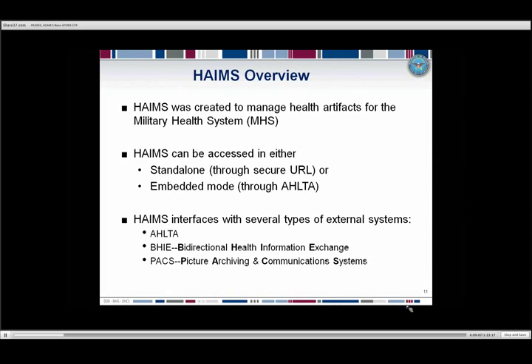And of course, PACS, the Picture Archiving and Communication System, no matter where an X-ray is taken, anywhere in the world, as long as you have a HAIMS account and you can access the HAIMS repository, you will be able to see that radiograph.